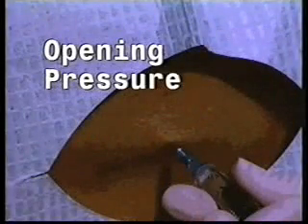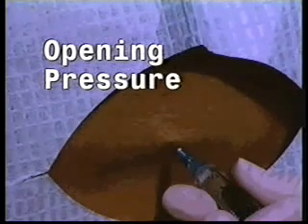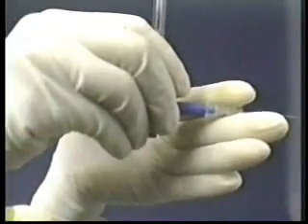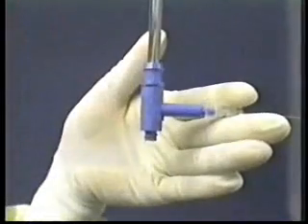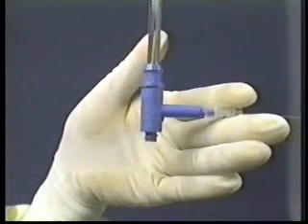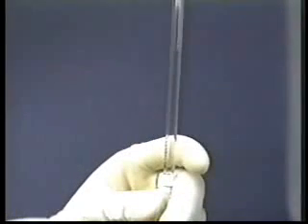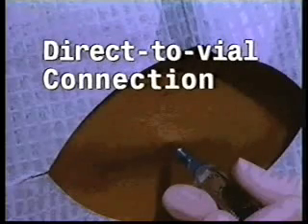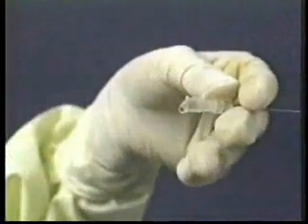Opening pressure should be obtained immediately after entering the subarachnoid space in the decubitus position. Attach the manometer to the needle and measure the opening pressure. The legs must be extended for this measurement to be accurate. Be sure the pressure has equilibrated for 15 seconds. Observe for respiratory variation. After obtaining the opening pressure, remove the manometer and begin collecting fluid.